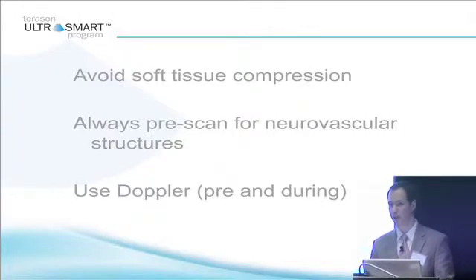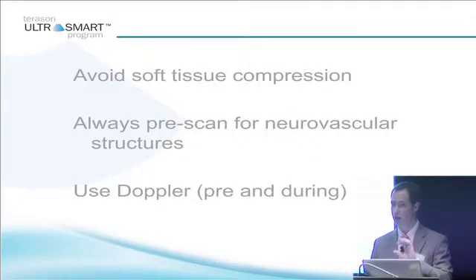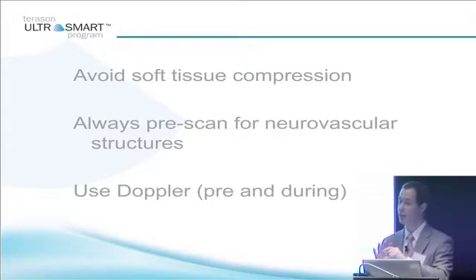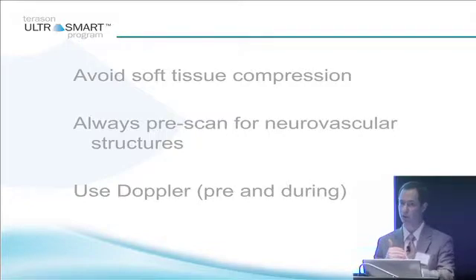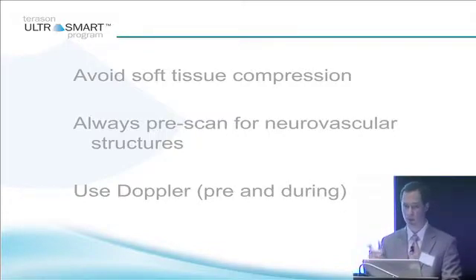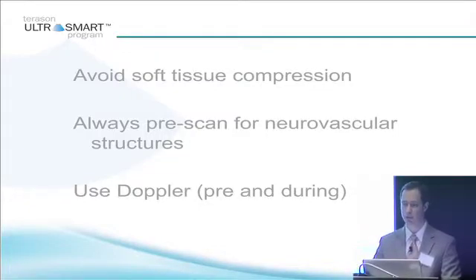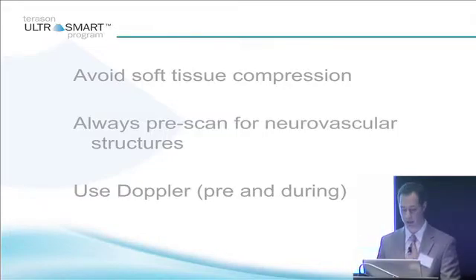And if you use Doppler during the injection, you can pre-inject with a little bit of lidocaine or saline and open up the area just a tiny bit. Remember that increasing that hypoechoic area in an isoechoic area will give you contrasting structures and improve your signal. So if you inject a little bit of something hypoechoic — any fluid, any lidocaine or saline — it'll allow you to hydro-dissect a little bit as you approach your structure, open it up, and you can actually see the injection flow into the area.